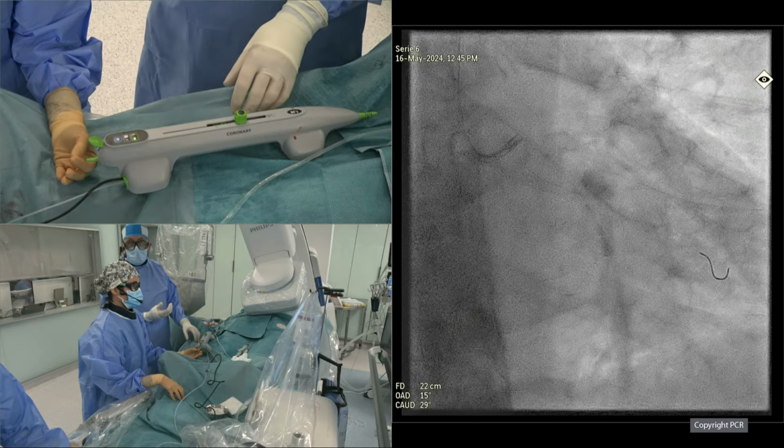Okay. I have the impression that the guide wire came back a little bit, or is it? Okay. So in that case, what you need to do is the following. You remove the brake. You put glide assist. Glide assist again. Okay. And now I activate the system and move the wire forward. You see? And now I stop. Okay. So that's the way that you do it.